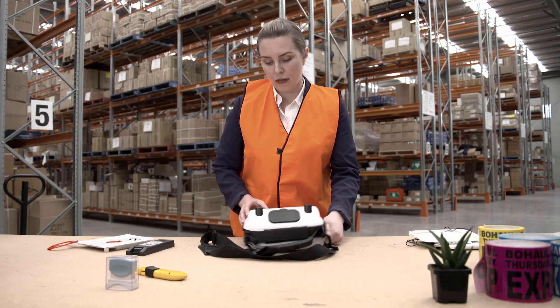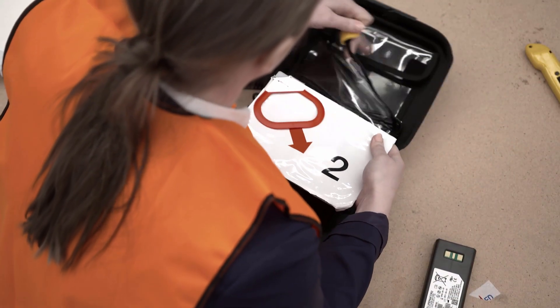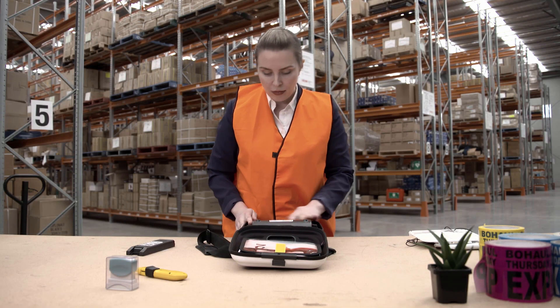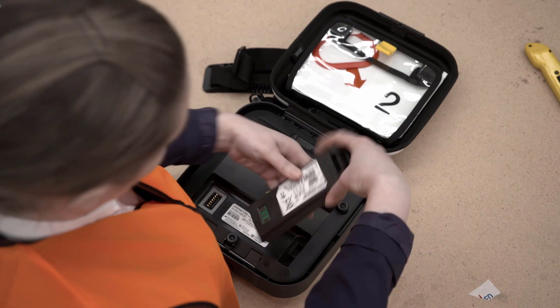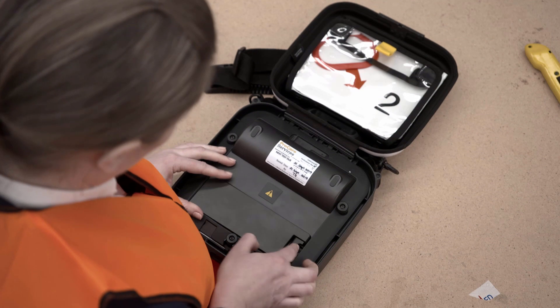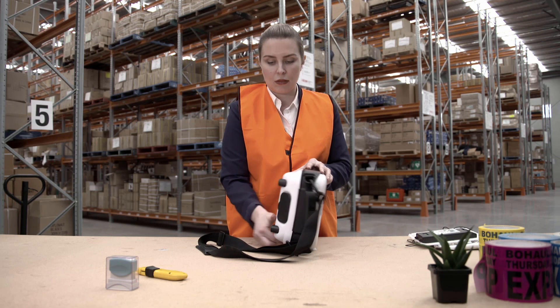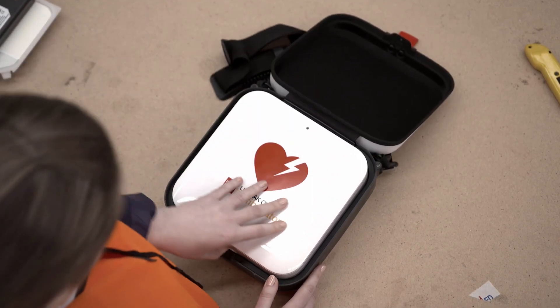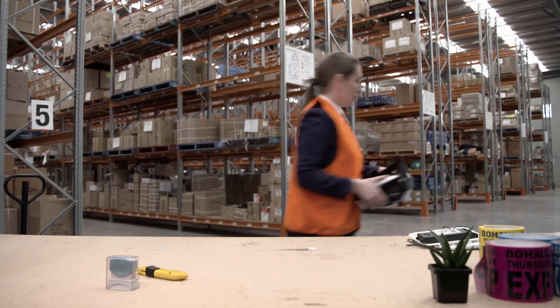Turn the defibrillator over and open the back lid of the device. You can store a spare pad pack in the back of the device. To change the battery, press the locking tab on the battery and remove it from the device. Check the manufacture date on the new battery and click into place. Close the back lid, turn the device over to the front, and allow up to two minutes for the defibrillator to self-test. Open the lid to ensure the device is working correctly, then place it back in your defibrillator cabinet.